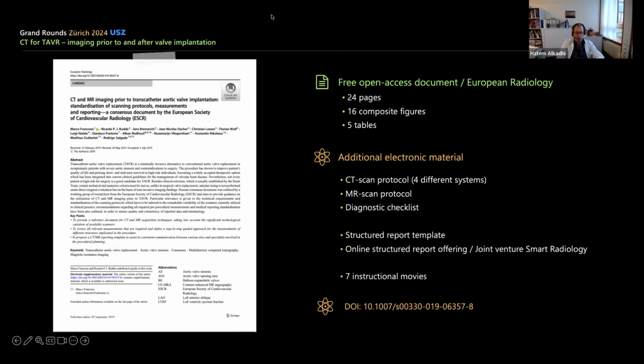Yeah, fully agree with this. This matches also our experience. Sometimes it's not possible for many reasons. It's not only the calcium. It's often the quite elderly patient, perhaps not so compliant, not hearing very well, you have to shout at him, with many comorbidities at that age, and then overall the image quality can be really critical. But sometimes it works amazingly well to rule out CAD, and then we should do it.